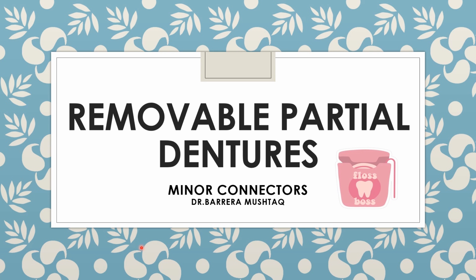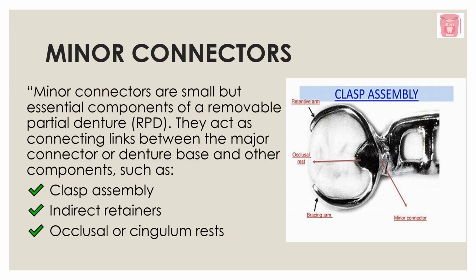Today we are going to break down an important topic in removable partial dentures. Okay, that is your minor connector. If you are a dental student or a budding prosthodontist or just curious about your dental prosthesis, this video is for you. So moving on to minor connectors. Minor connectors are a small but essential component of your RPD.